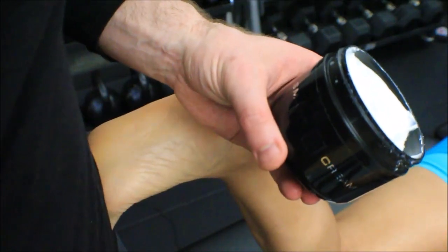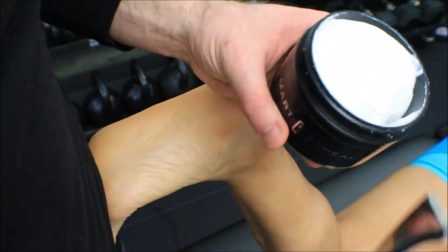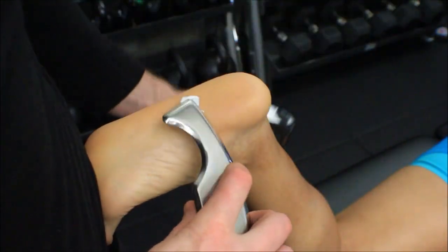All right guys, for your close-up recap, I'm going to use just a little bit of cream here on the bottom of the foot.